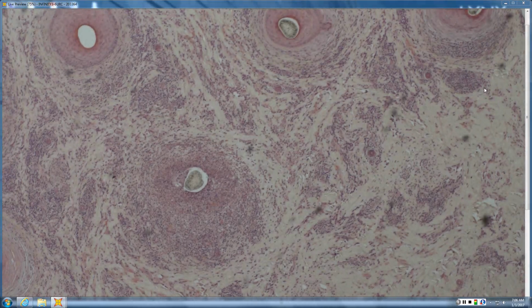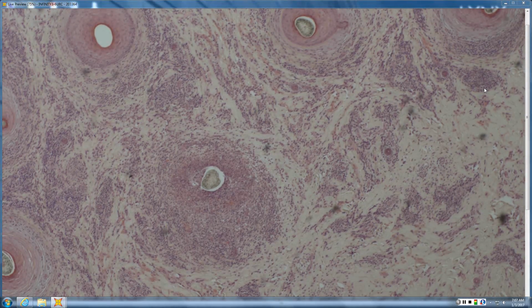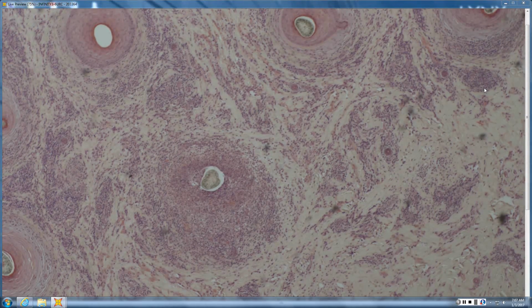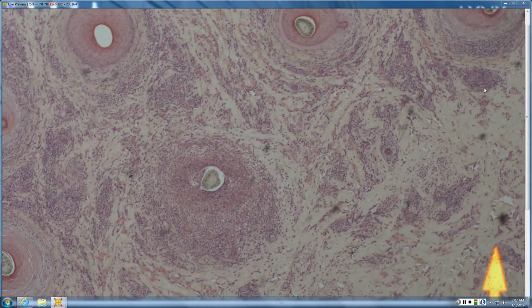But in this case, you see some evidence, and we don't have a whole lot of transverse section examples in this unknown box, but there's a lot of people who all they ever look at is transverse sections. So it is good to look at these and to be able to assess them. With this transverse section, you're not really getting as many hairs as you should. So there's a lot of dropout and scarring. Now it can be hard to tell that when you have all this suppuration in here, but just believe me, there's a lot of scarring going on in here.